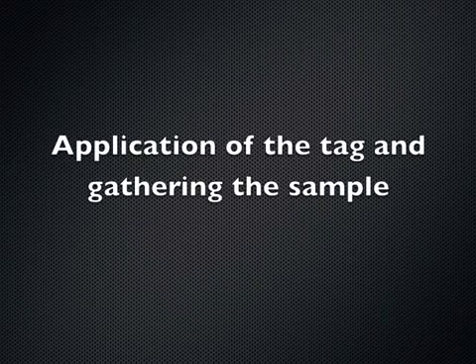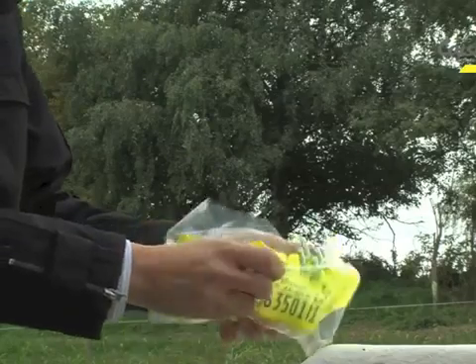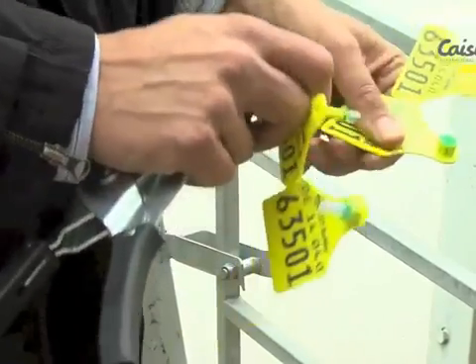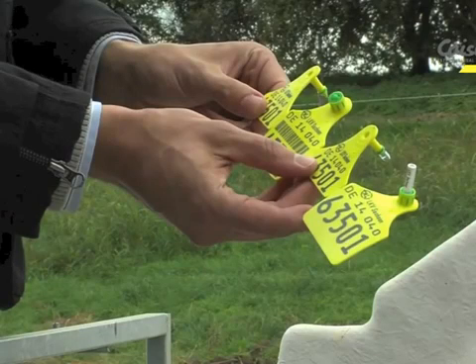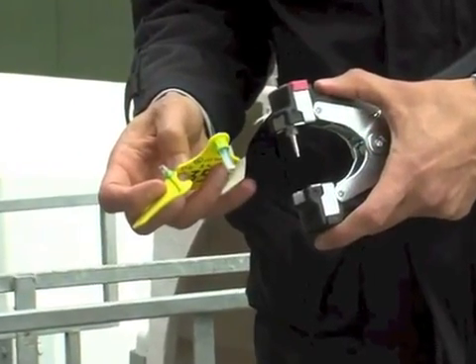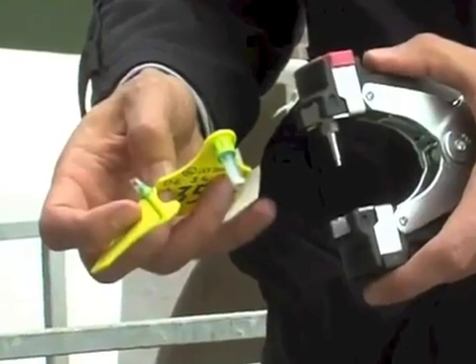Application of tags. Open the plastic bag with the first batch of tags and remove the strip with the first number that you want to apply. Each strip will give you all the items you need both to tag and to take the sample. The tag for the BVD eradication program takes a sample from one ear and puts an ordinary visual tag in the other ear. Firstly, fitting the sample tag. Separate the two parts of the sample tag and put the visual tag away for safekeeping.